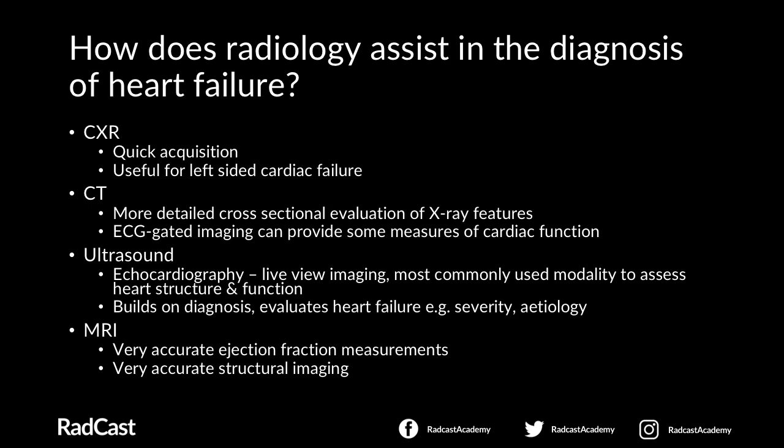CT can be useful if we think of this modality like a more detailed X-ray in this case, because this is essentially what it is behind the scenes, cross-sectional imaging using X-ray radiation and attenuation to form a cross-sectional image. Helpful if we want to perhaps confirm what an X-ray might suggest in sliced cross-sections and improve our accuracy, but again we're probably not going to rush to CT scanning to gain any helpful measurements of heart function. It is technically possible if the images are acquired in time with a patient's ECG tracing. This is called ECG gating, but much more popular is the echocardiogram.